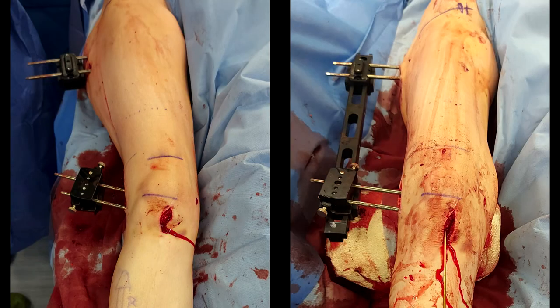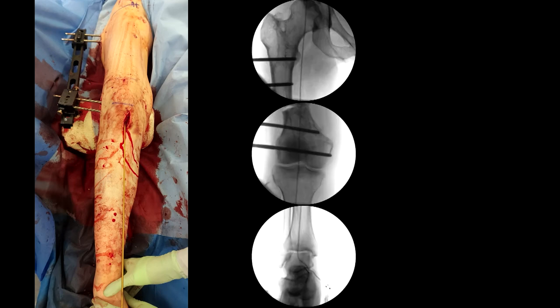So we've applied the two blocks of fixation onto the rail, and you can see that that's lying at that 10 degrees to give you, hopefully, a correction into the anatomic axis. And then, as Hemant said before me, check your alignment.